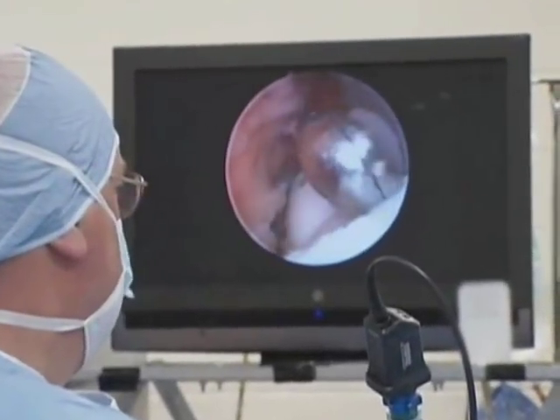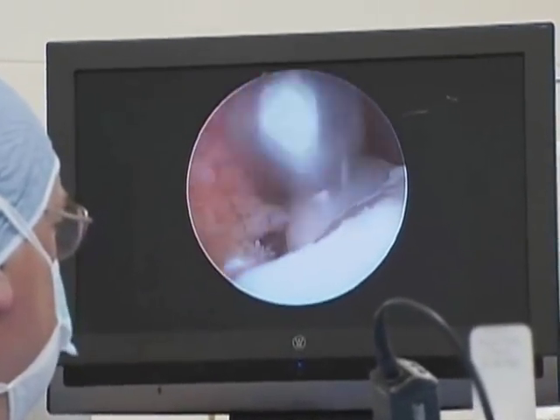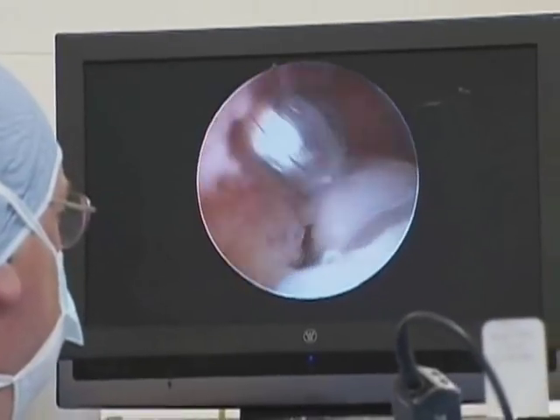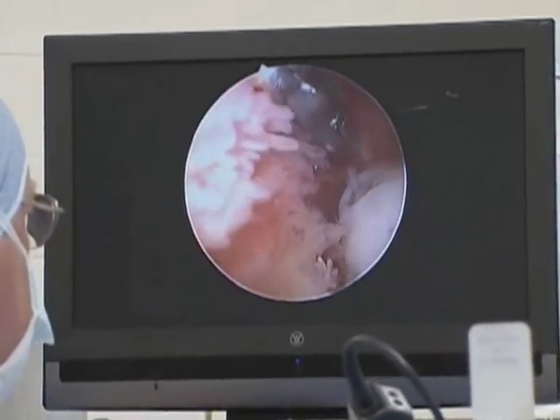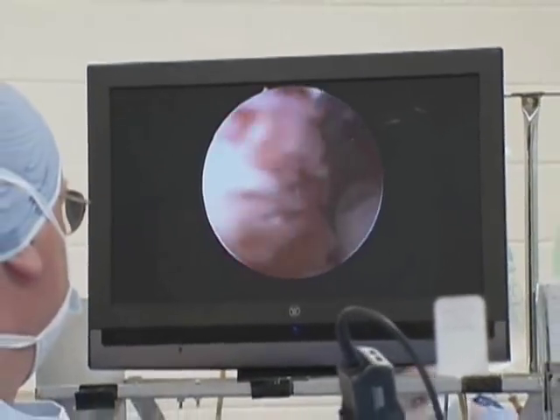When I remove the fragments, the bone will scar over, and that debris will no longer be shed inside the joint. It's the debris that causes the damage, and it's this inflammation of these villi that would later become arthritis for this horse.